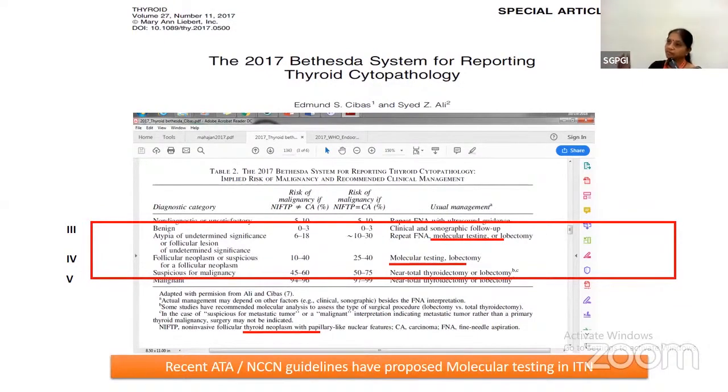I call it category 5 when something is forcing me to call it 5. I would have been very happy to have all the material to call it a frank papillary thyroid carcinoma, but there was some limitation, which is why I put it into category 5, and we do cross consultation. We show it to others in the department, and this was a consensus. But that is where the dilemma comes, that not every surgeon would even operate.